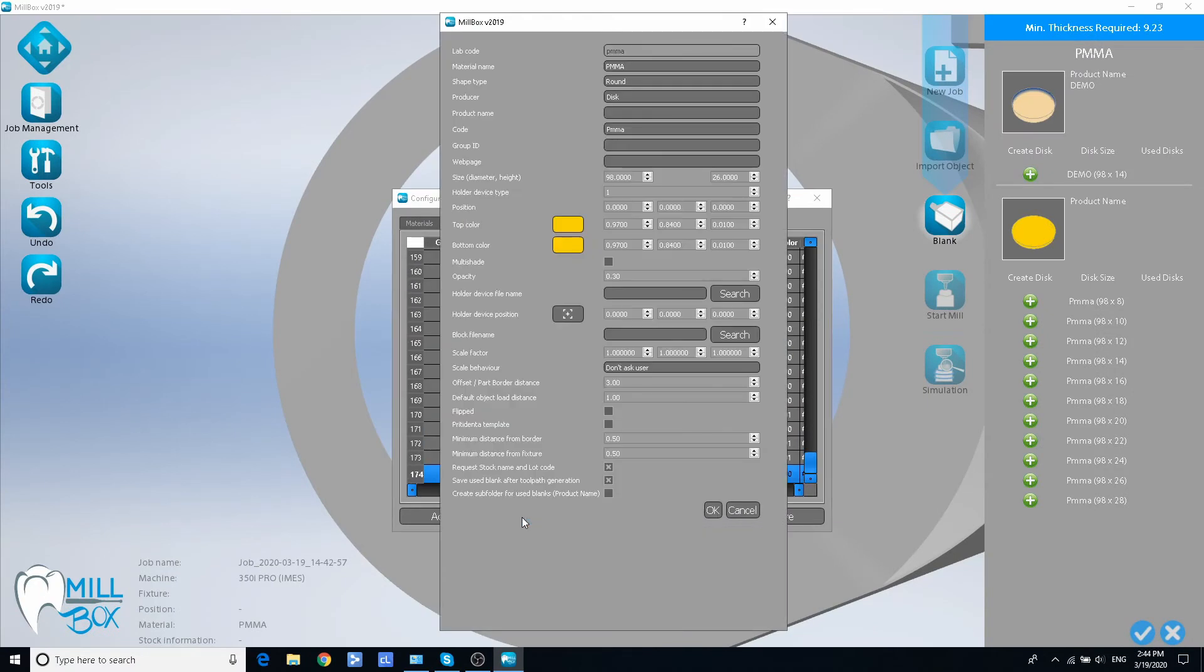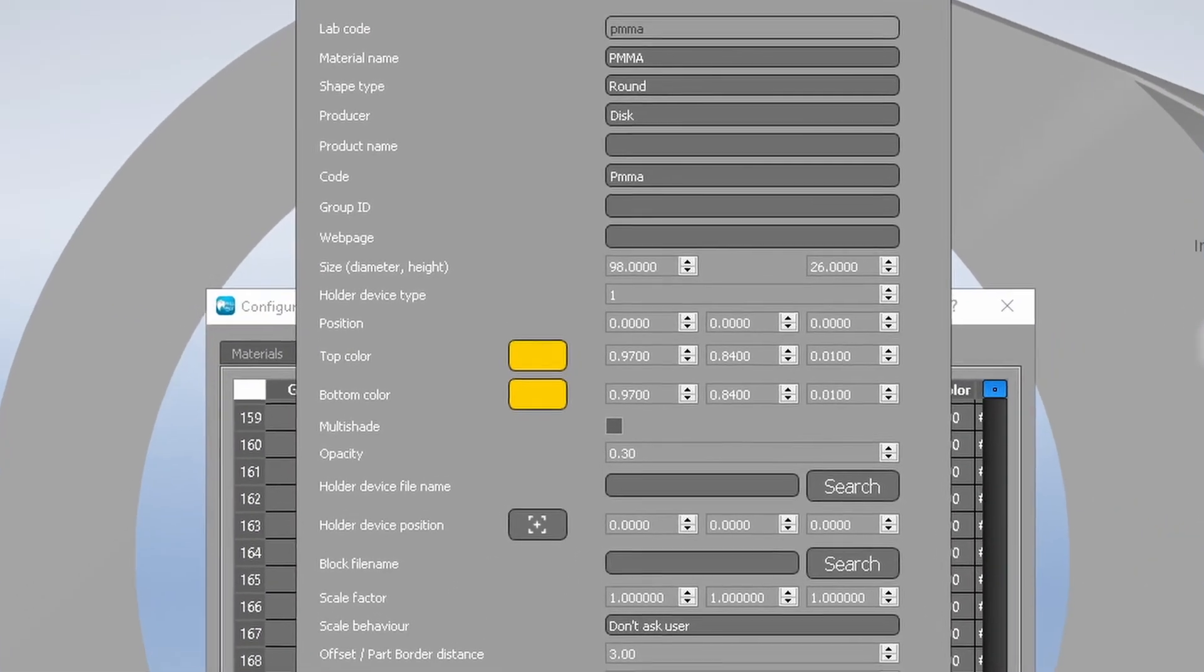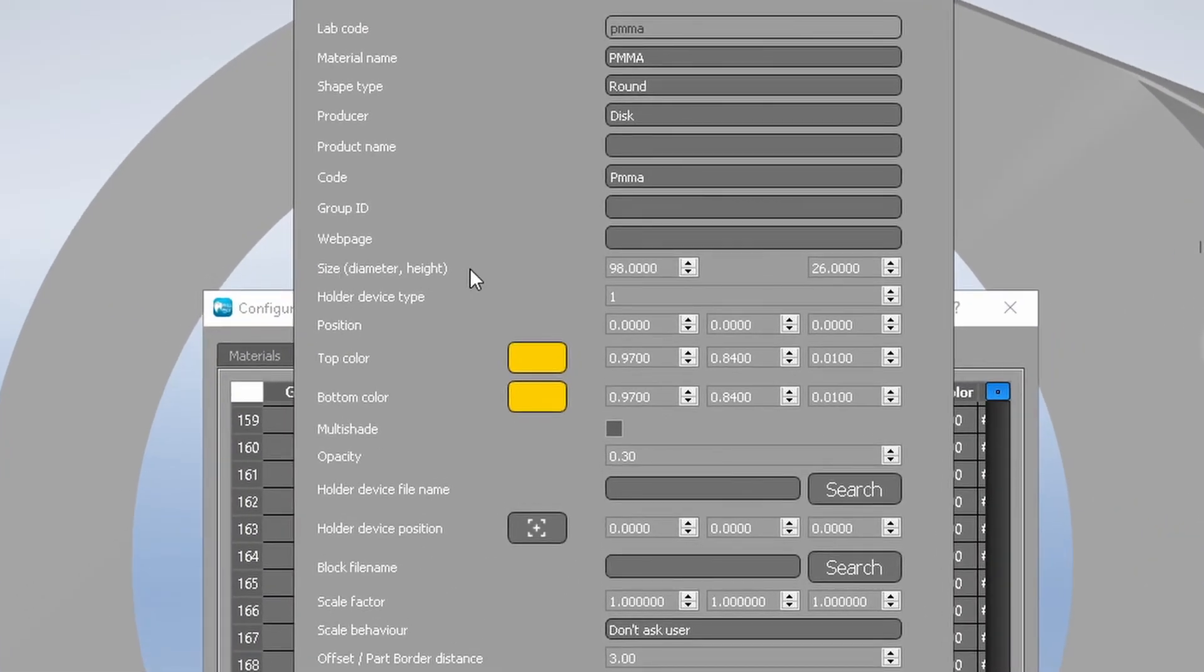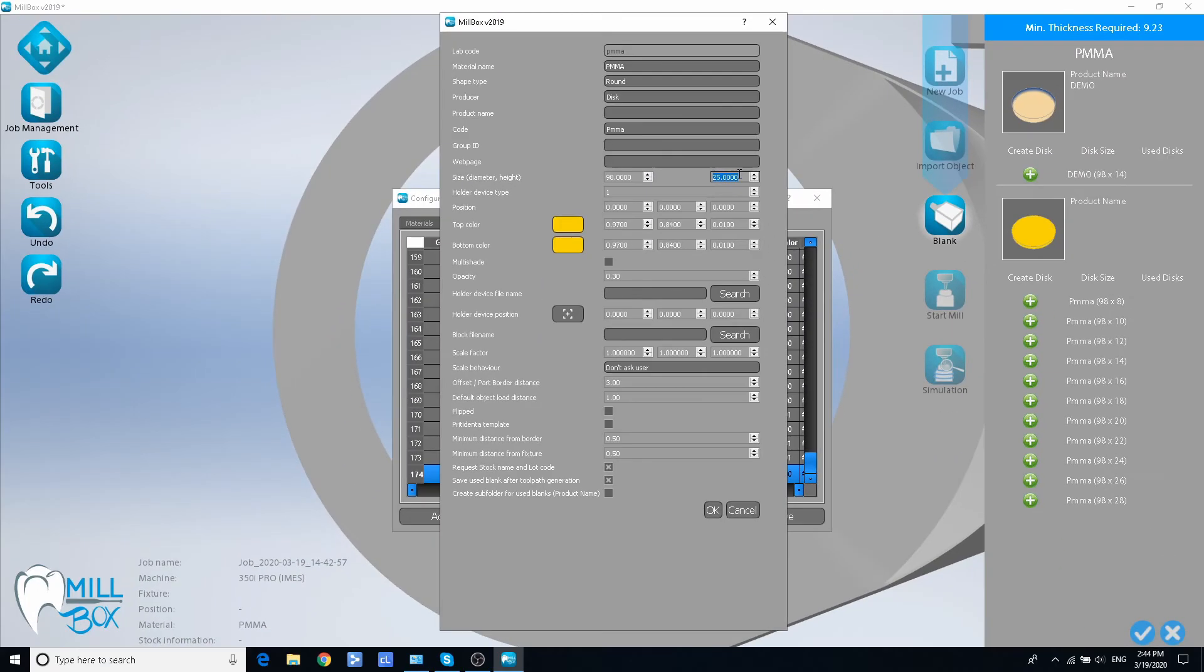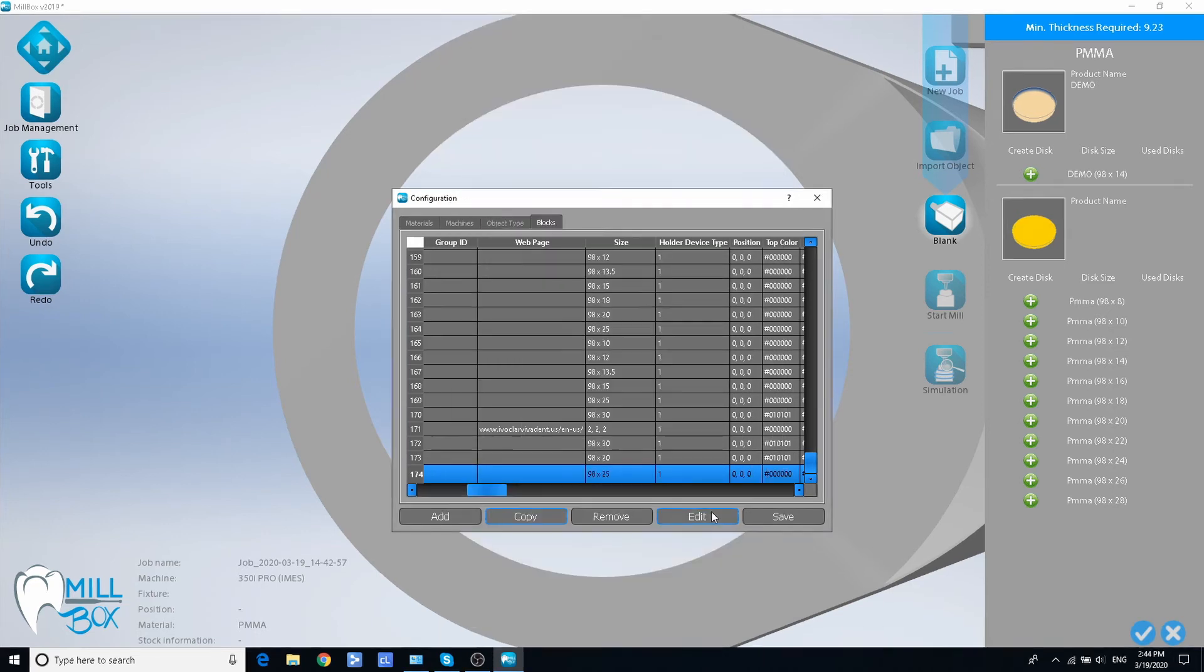In the open window find size line and change blank thickness to the value you need. Leave other fields unchanged. Click OK in the bottom when finished.